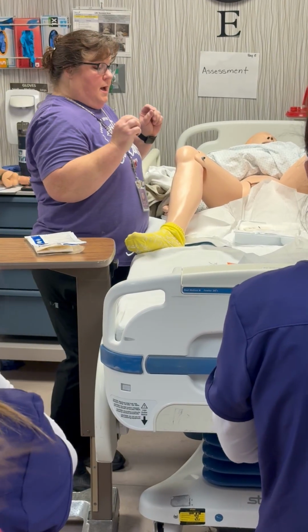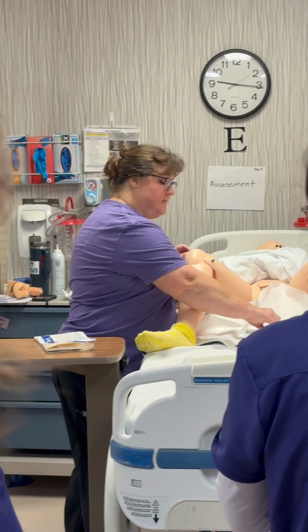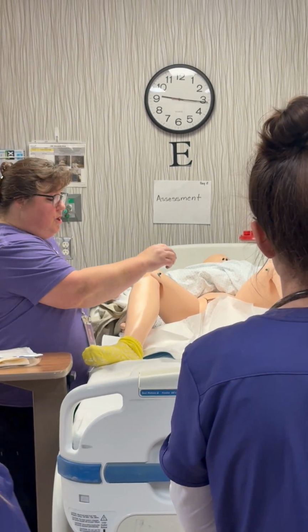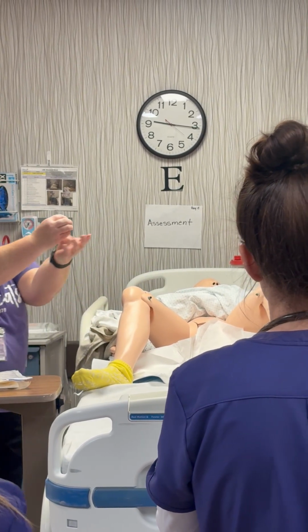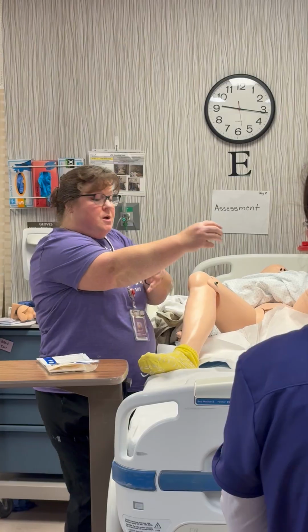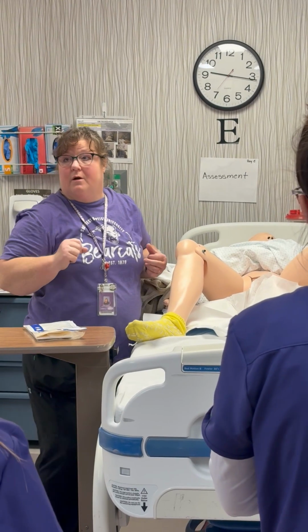So you're going to take and pinch and get rid of these gloves. I'm not touching anything else on top, and I'm going to get rid of these gloves. So when I'm taking stuff out of my sterile field, you're going to make sure that you don't run over the top of that, okay? Because think about all of these germs, microbes, hair, everything that can fall down into your sterile field, okay? So you want to take as many things out and around as you possibly can, not over the middle, okay?